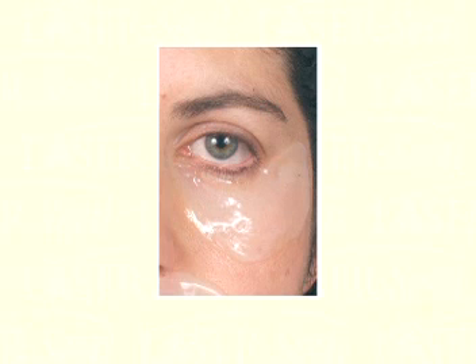People say you look like you have a sunburn — that's all. But it didn't hurt. The semi-transparent silicone mask allows close monitoring of the skin for signs of infection or complications in the days following surgery.